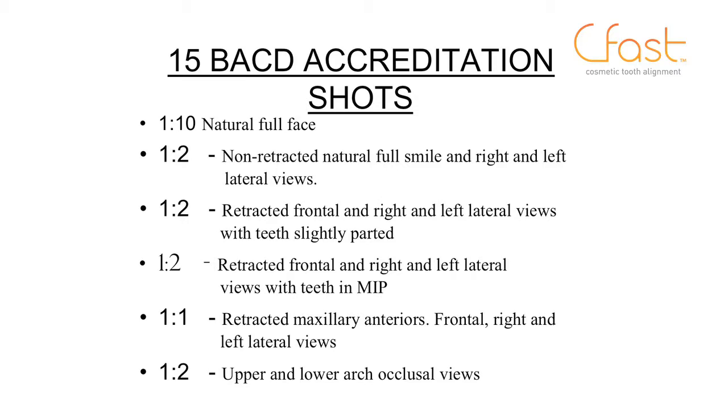And the reason I take all of these is not every case is a Cfast case, and I get into the habit of taking these shots, and then I have the photos I need for Cfast, but I have the photos that I need if it's not a Cfast case. So it's a good habit to get into, taking all of them, because it takes no longer.